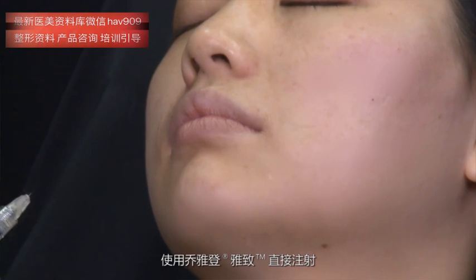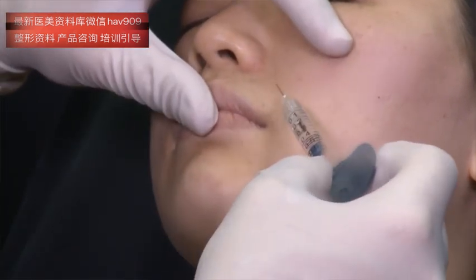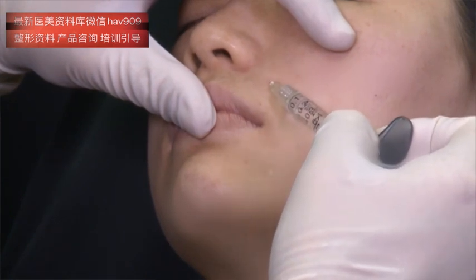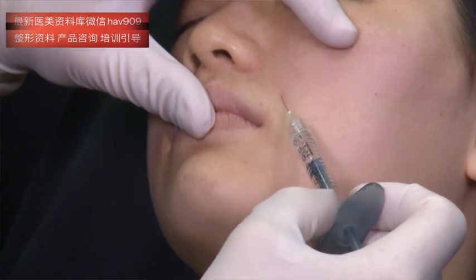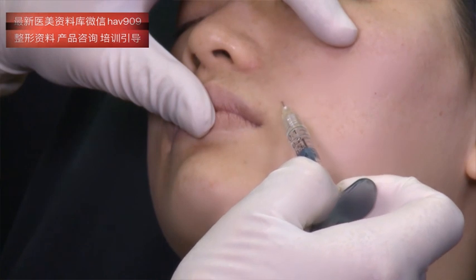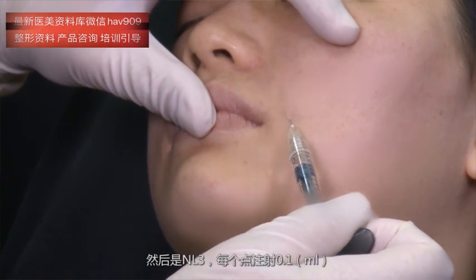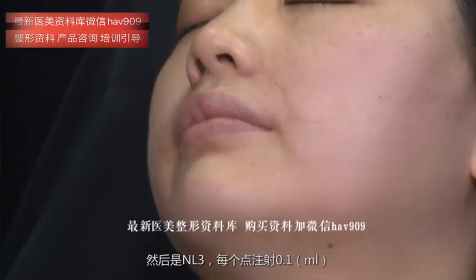Now injecting directly with Ultra. And then NL3. So 0.1 in each point.